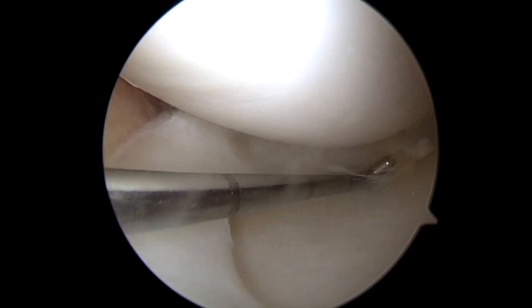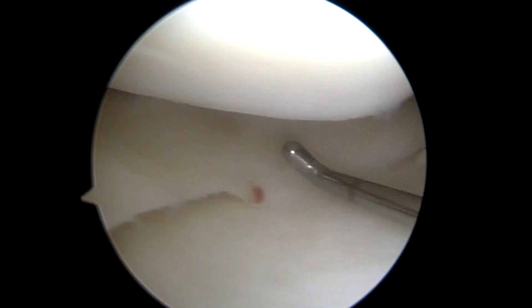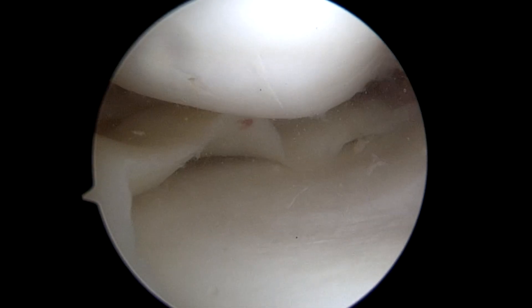Here's her bucket handle medial meniscus tear being reduced into place. You can see it's detached from the capsule in the back. There's a remnant that's attached to the capsule, and it needs to be sewn back to that remnant right there in order for it to be stable and heal.